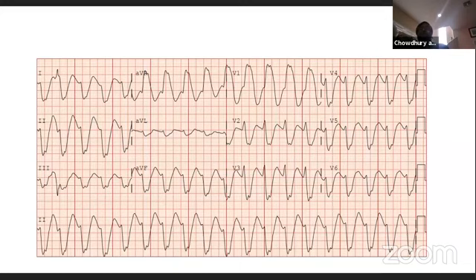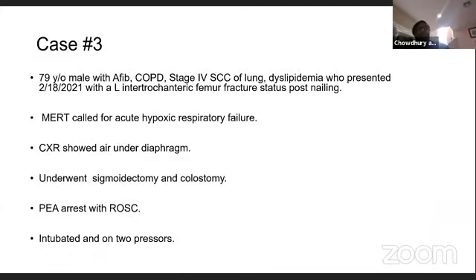But the ST segment elevation, like in this one, confuses people, and people are worried about whether it can be a STEMI. So that's another important issue.